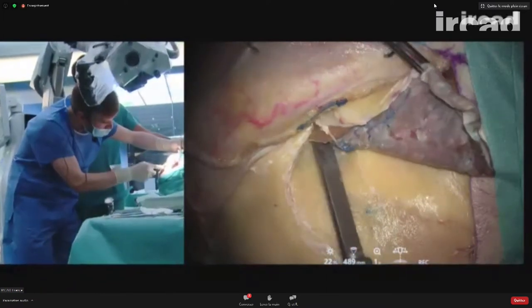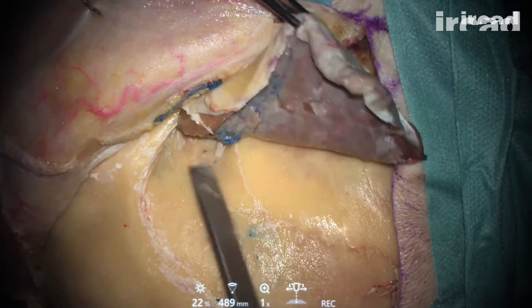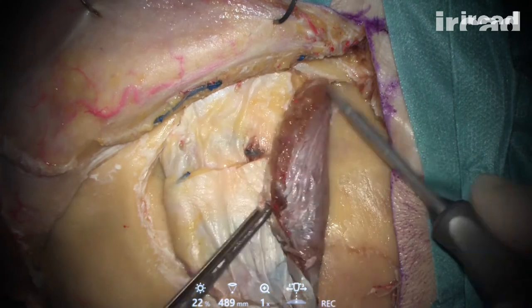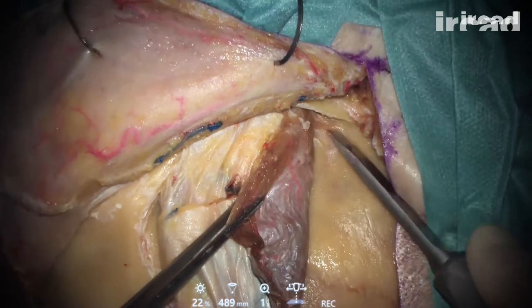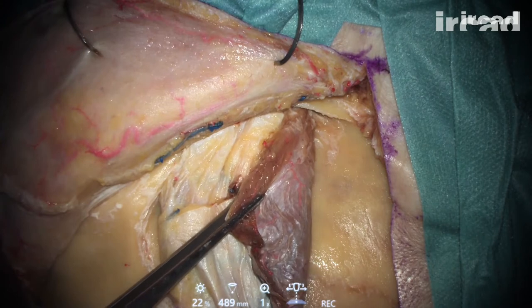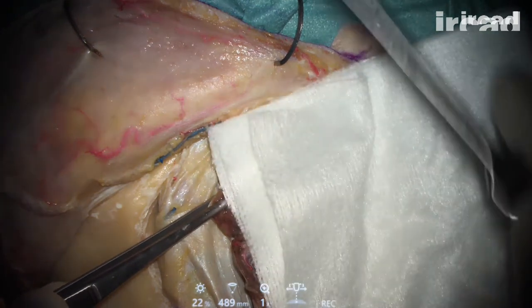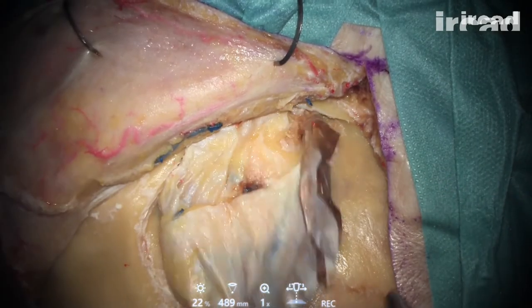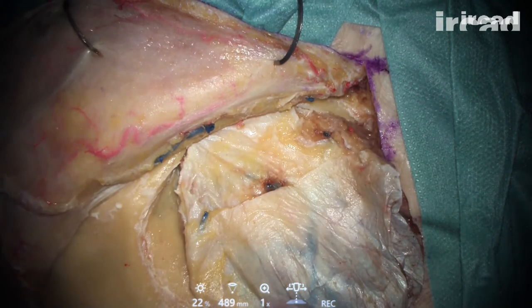Always down, up, even here. This movement of my instrument down up is mandatory to keep this muscle intact. Here down, I release the muscle from the zygomatic arch. Down up also. I can use a sponge to release it a little bit more. I can say that the muscle is almost completely free and intact.